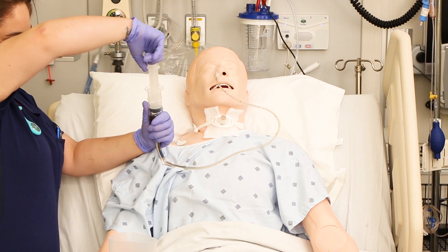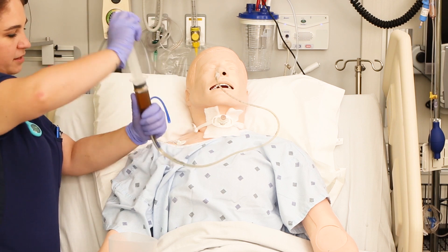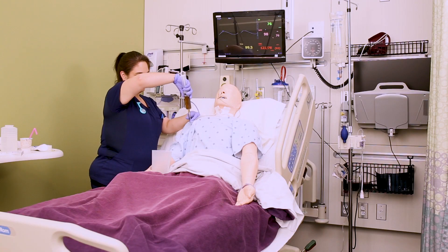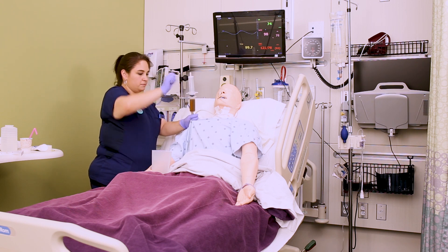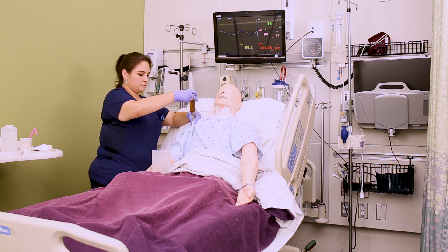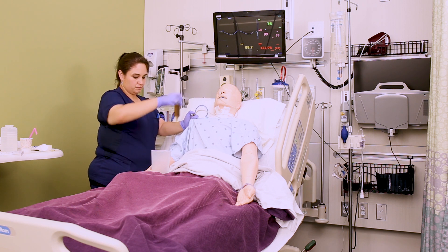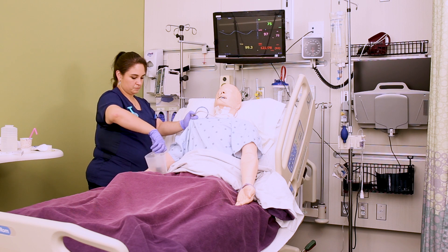For the harder silicone Salem sump tubes, you'll have to physically bend it to clamp it. This is something we used to do routinely every four hours, but evidence-based practice now shows it's actually not recommended to do routinely. Instead, we usually check anytime we suspect a problem, like signs of reflux or abdominal distension. Once you're getting air bubbles, keep pulling until you physically can't pull anymore, then measure the total volume. We don't really get concerned until we're over about 400 to 500 milliliters.